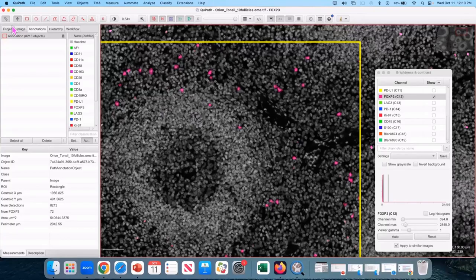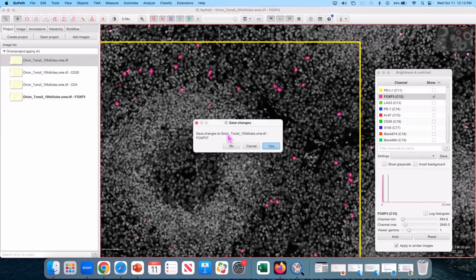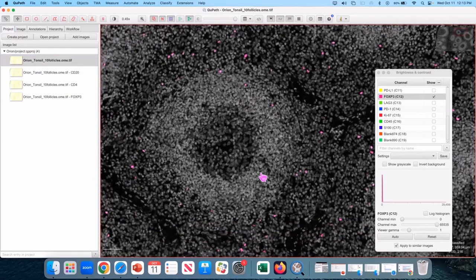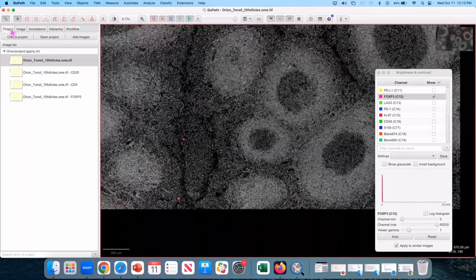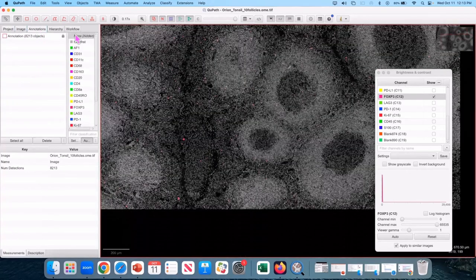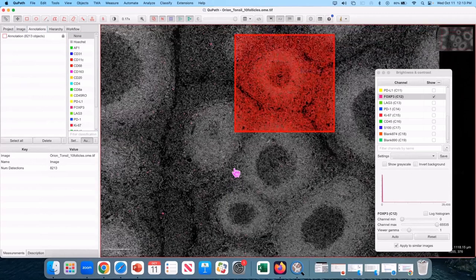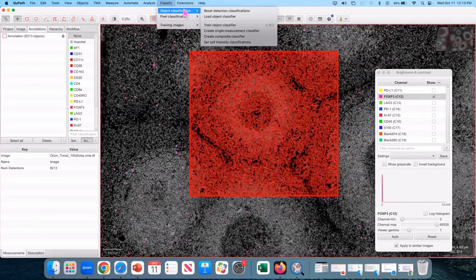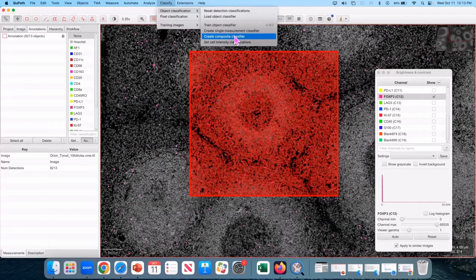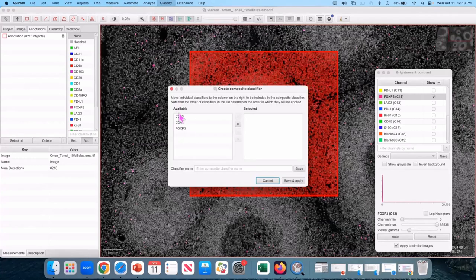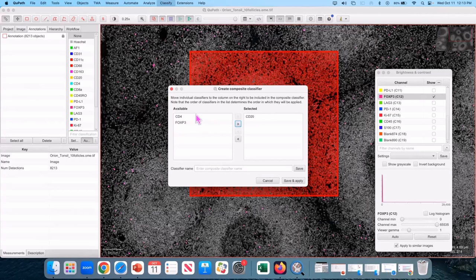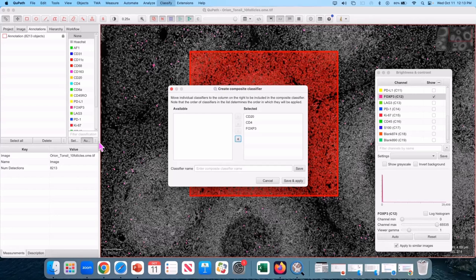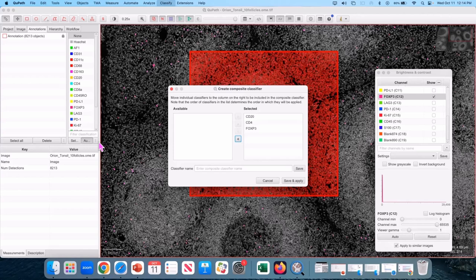Who's got three classifiers? Go back to the original. So now you should have cells which are hidden because I hid the none cells and none of these are classified. Classify, object classification, create composite classifier. And I'm going to add my B cells, my CD4s, and my Tregs together. The order changes the final order in which they will be listed. So if you want to see CD4 positive, FOXP3 positive, add them in that order. If you reverse them, it'll say FOXP3 CD4, but it won't actually change the numbers. That's purely aesthetics really.